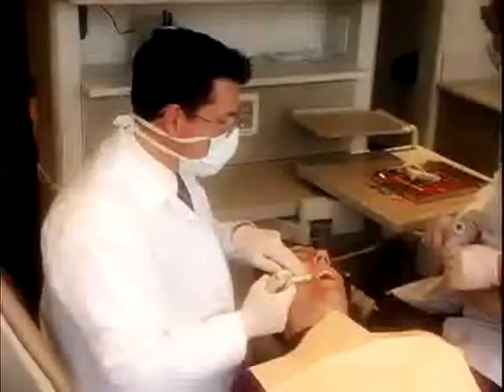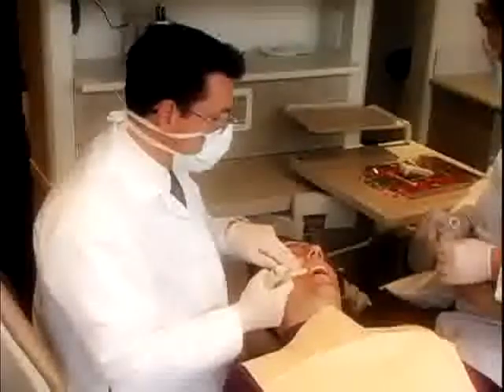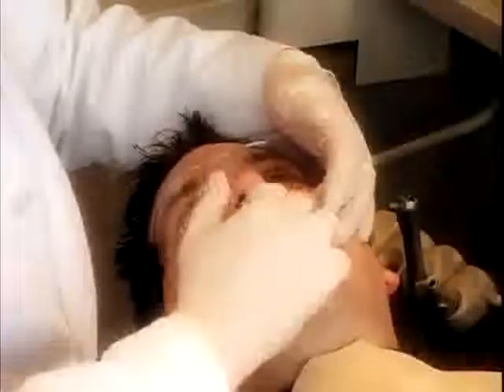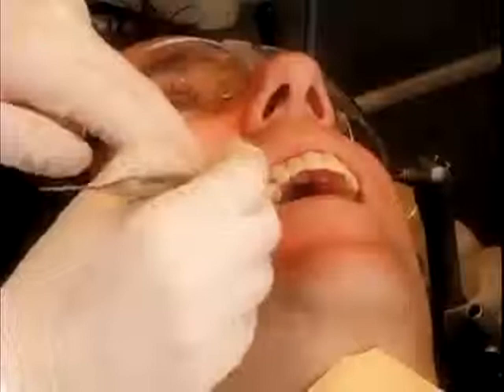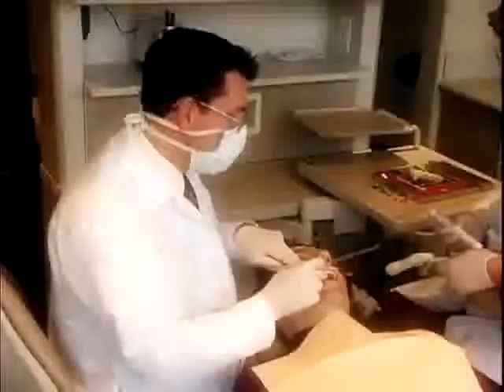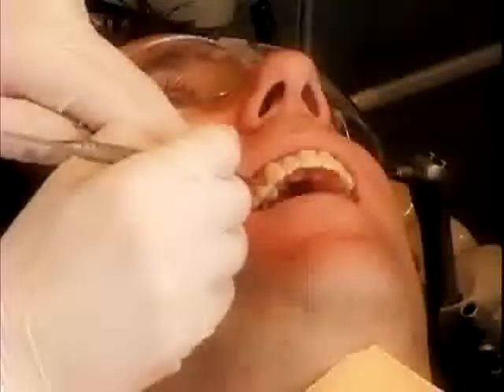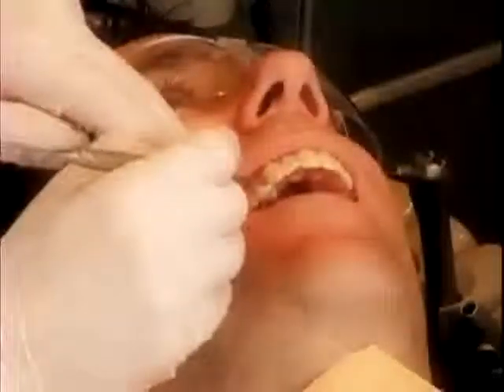Then I'll be doing a test to determine whether we need to carry back even further to create the most complete smile that we possibly can with the least amount of cosmetic activity. As I'm working, you can see that Randy's smile is evolving quite rapidly. The spaces have been addressed, and the color is definitely starting to be uniform and complete throughout. This procedure, by the way, is completely pain-free.